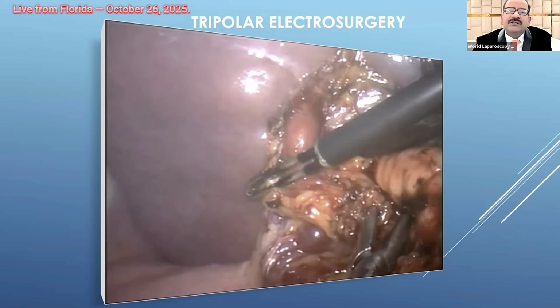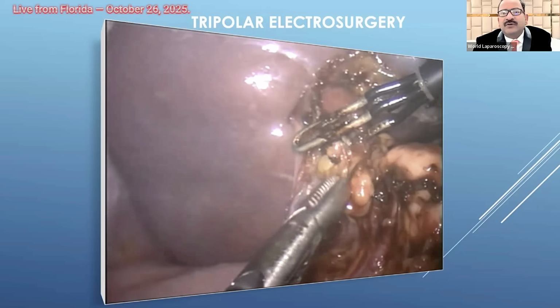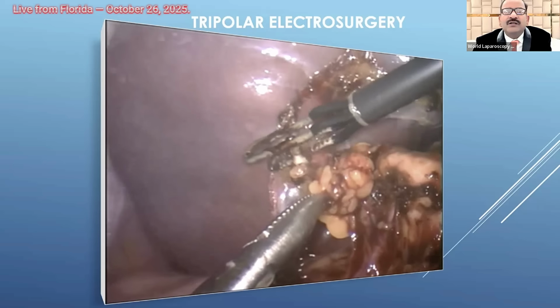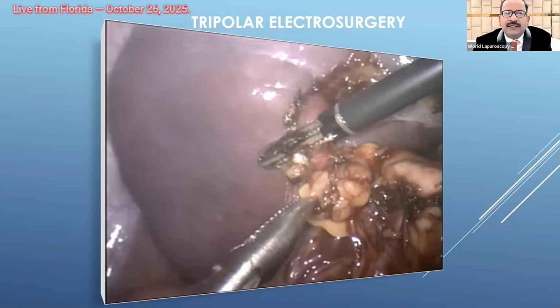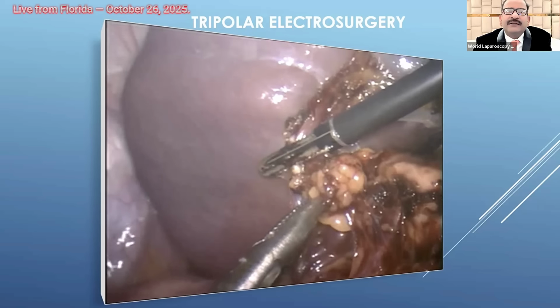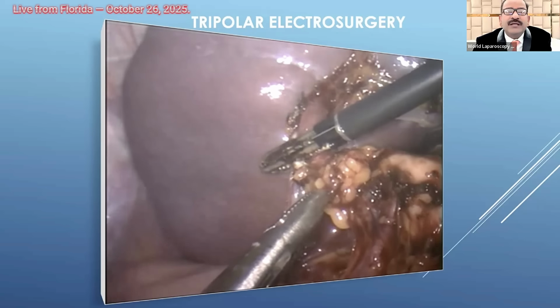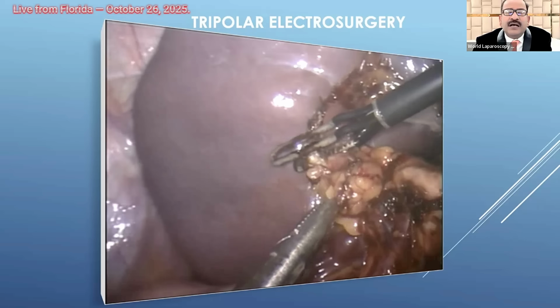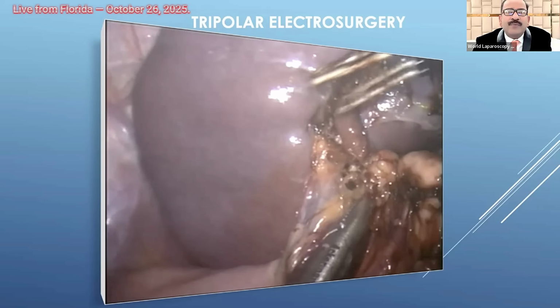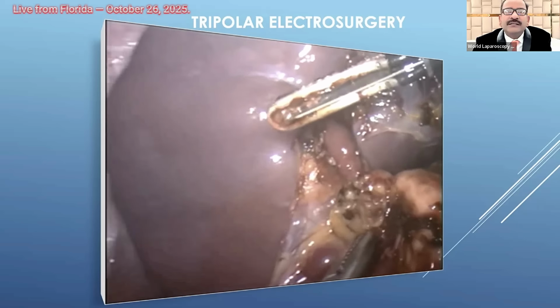And then once it is coagulated, you can see during coagulation no traction is given, because once you give traction it won't coagulate properly. And then after coagulation there is a blade coming, and this blade will cut. So your instrumentation time will decrease. You don't have to repeatedly bring the scissors. Otherwise you have to apply bipolar, bring the bipolar out, and then bring the scissors.